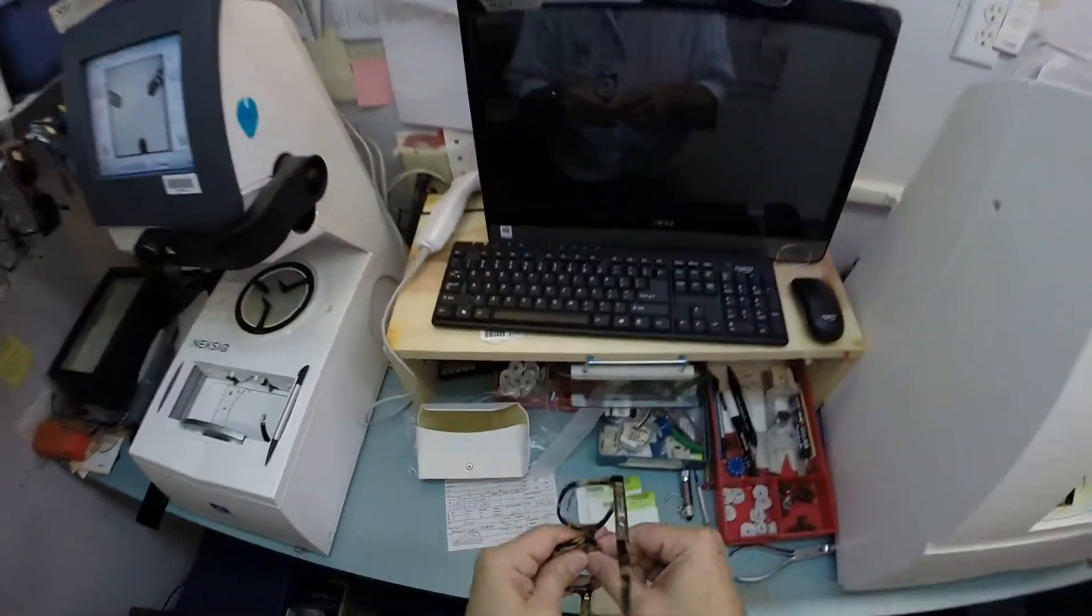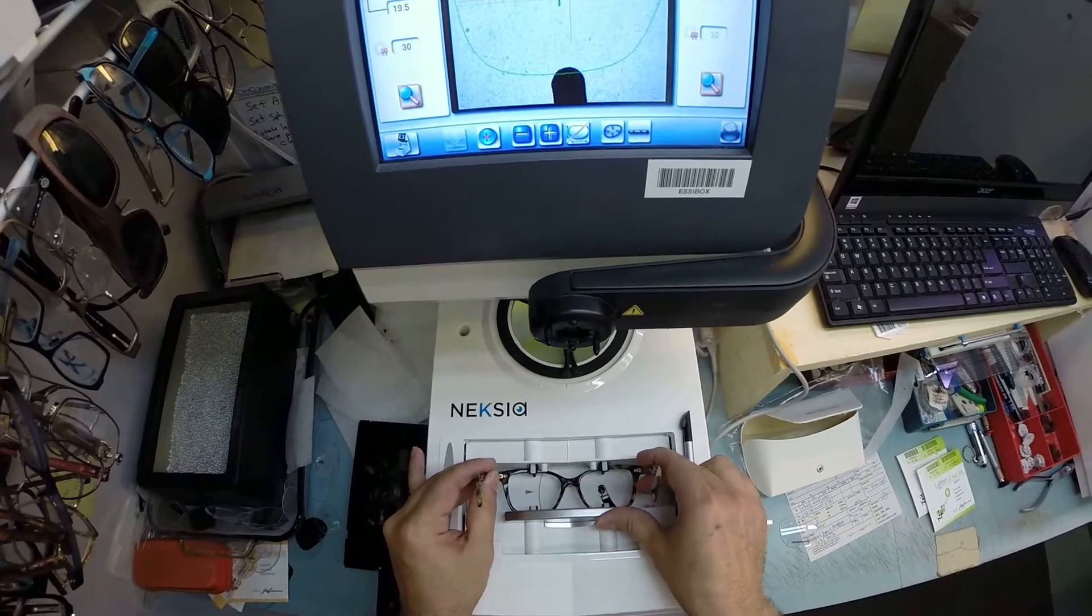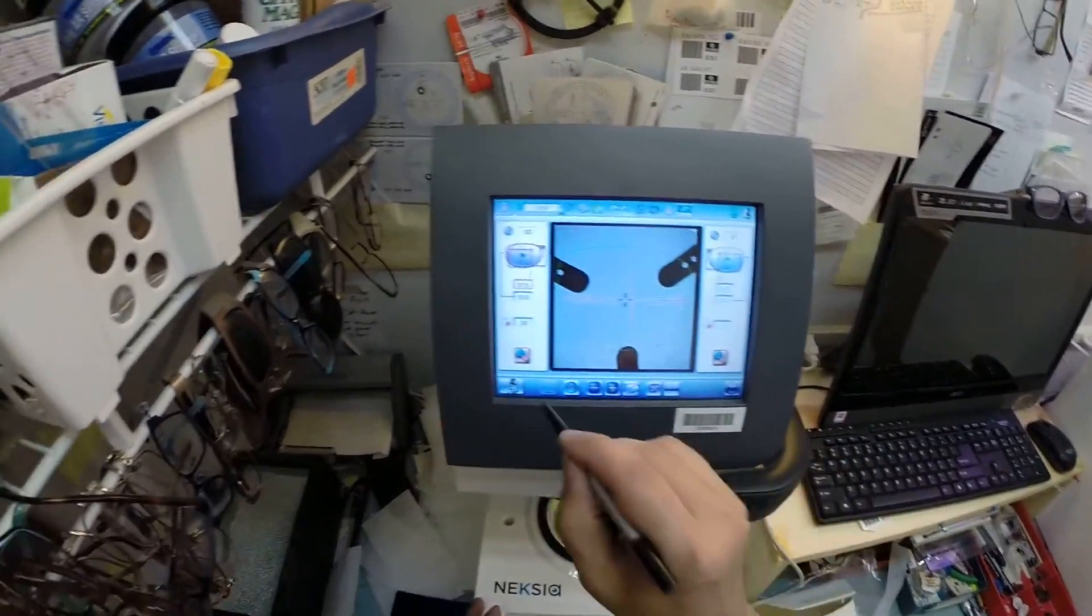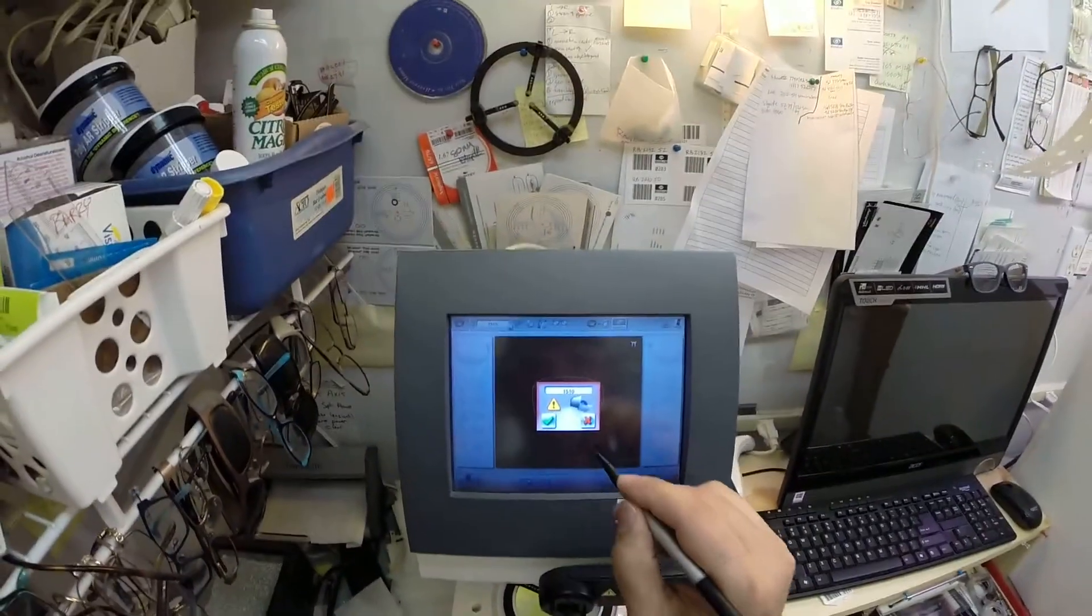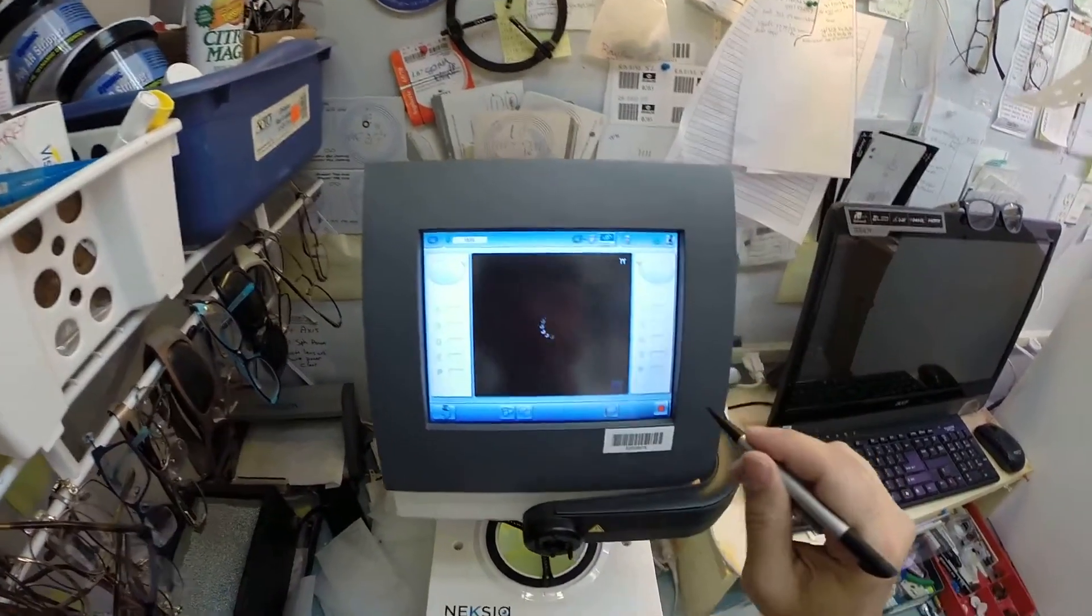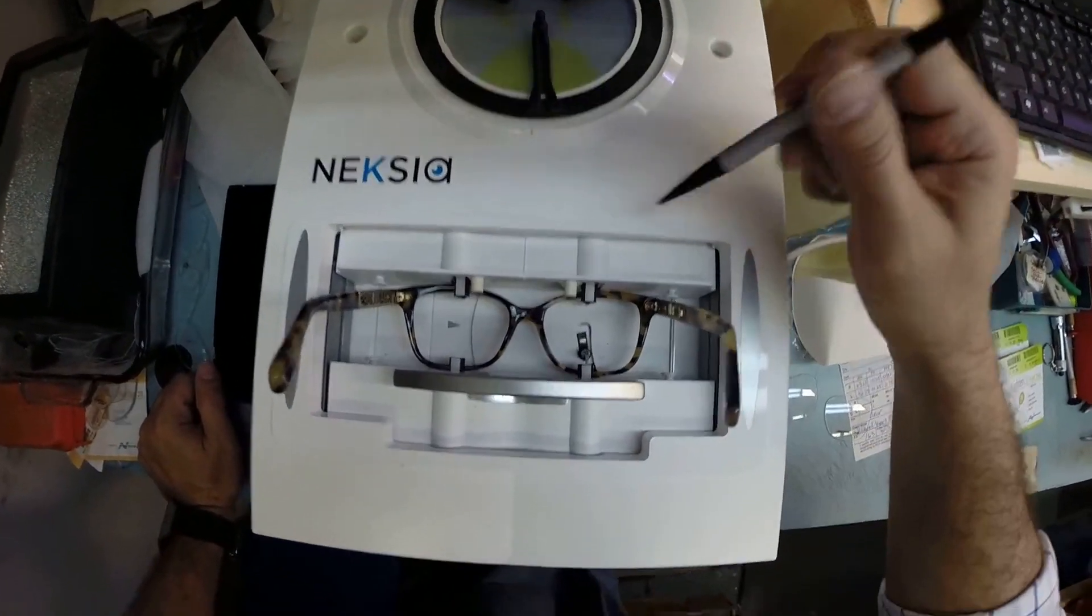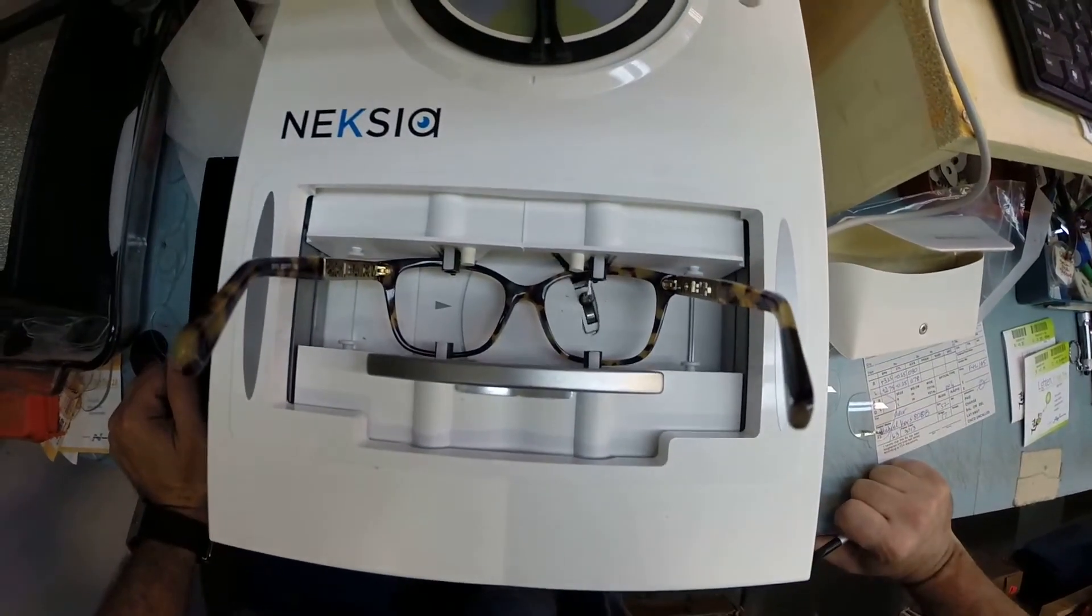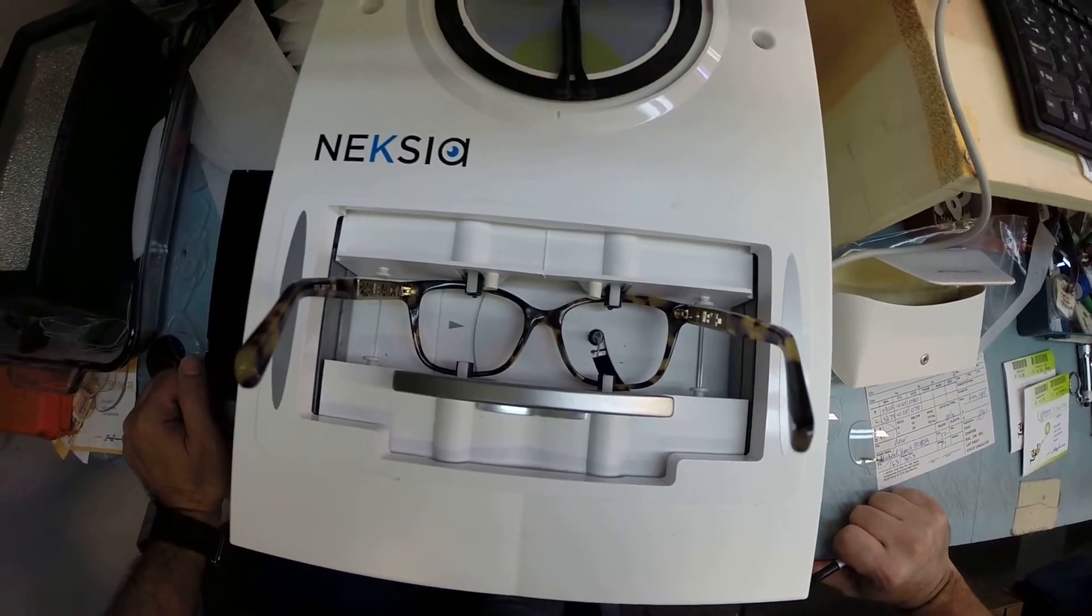I'm going to pop these out and I'm going to put your frame into the tracing element of my edger. I'm going to trace the shape. Everyone wants to know how the computer knows what shape lens to cut. This is why. This stylus pops up, goes around and traces this shape of the right side first before moving over and tracing the left.